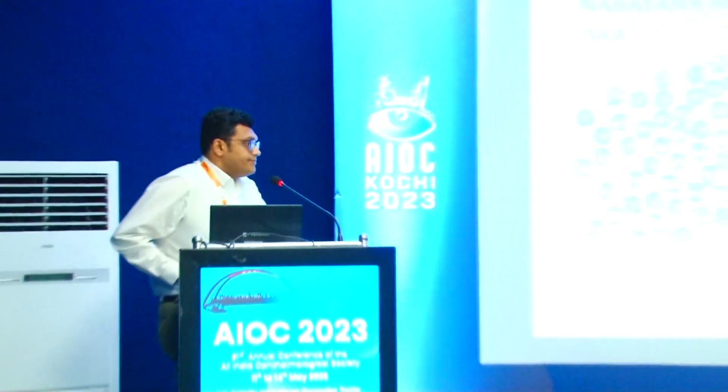OCTA would have helped you. So the OCTA, because we wanted to talk about the OCTA, because the HCD we said is associated with poor visual acuity. So if you had done an OCTA, we would have also seen whether there was any macular ischemia in these patients, and whether that was responsible for the hard exudates and the crystallization or the cholesterolization of the hard exudates to happen. So whether there would have been an additive factor, the OCT angiography would have told us that bit of information. But you can pick up ischemia in the fluorescein also. In patients where you are not doing diabetic, I don't think you need to pick up ischemia with the OCTA.